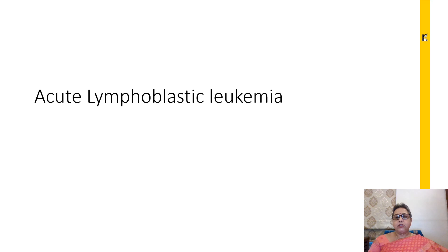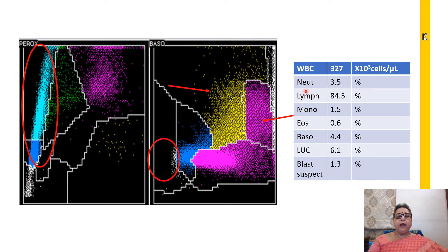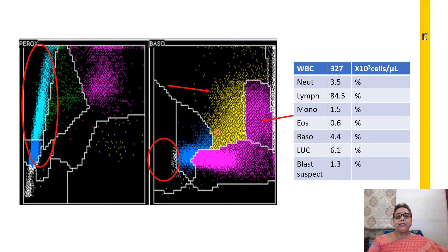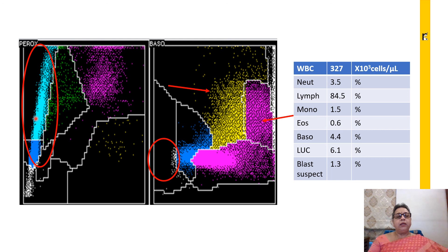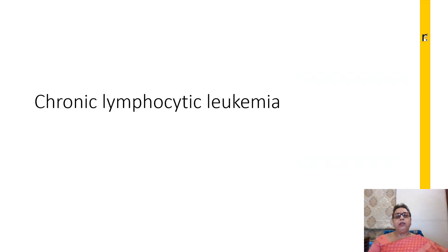The next case has a high WBC count with most of the cells being lymphoid — most are lymphocytes, very few LUCs, and a small apparent increase in basophils due to the scatter. Blast suspects are very low, hardly any blasts are visible. Given a high count in an elderly male with most cells being lymphocytes and very few larger cells, the suspicion should be in favour of chronic lymphocytic leukemia.